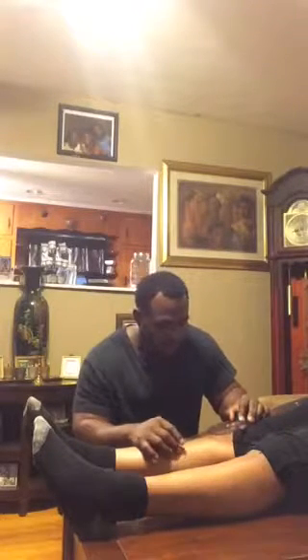Get it on the 0. Now I want to line this moving arm up with her tibial tuberosity. So I palpate it and I feel it right here at the knot. And just going to line this movable arm up with the tibial tuberosity. And it gave me about 15 degrees, so that puts her in the normal range on this side.